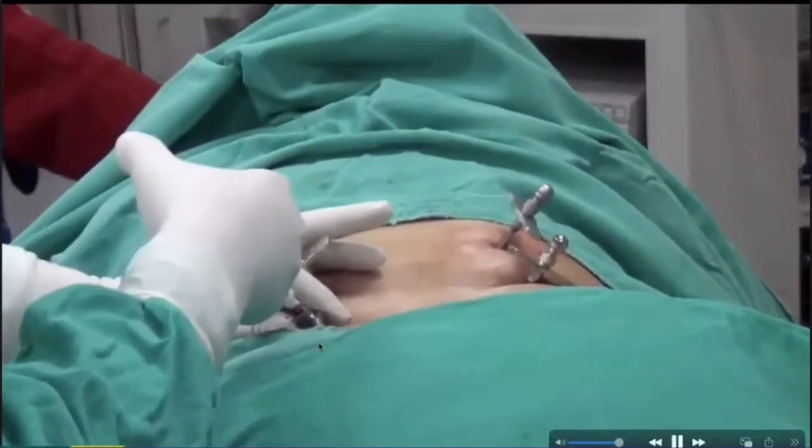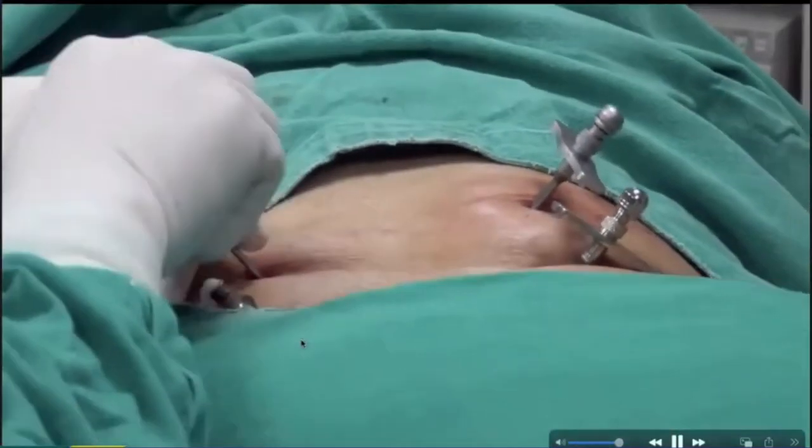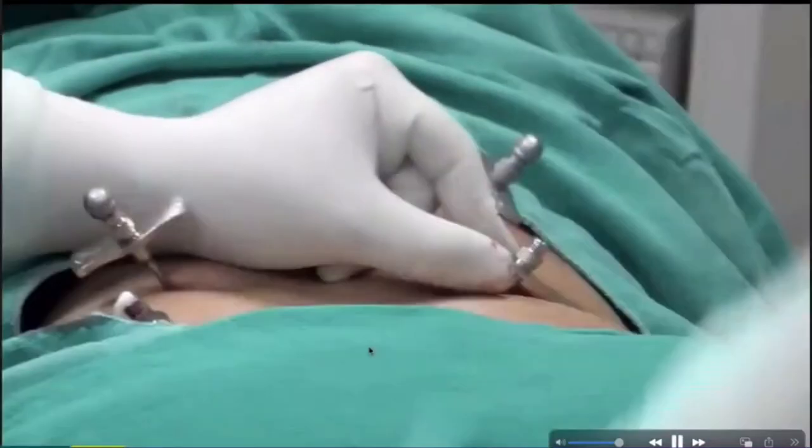And I keep changing my needle if need be. I let the cement harden in there. It's like an RF. You put 2, 3, 4 needles of RF. You're doing one RF, you're putting second needle in, and second RF, third needle in. So you're saving on your time. And that is how it has been done.